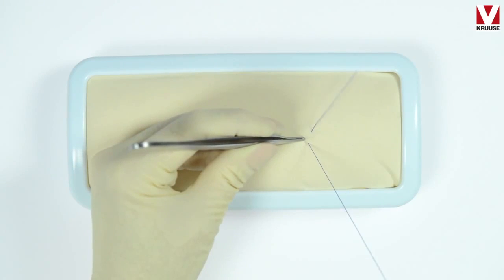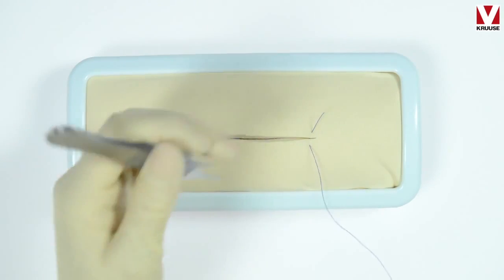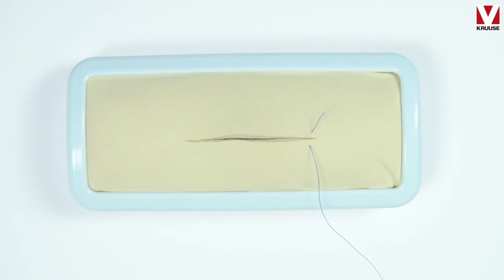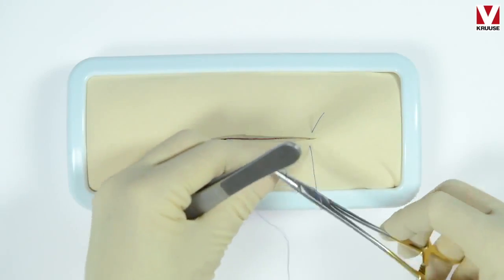You start with a normal suturing knot on each side, then you will make a 2-1-1 throw, as you see it here.